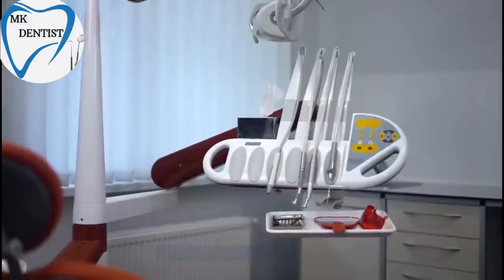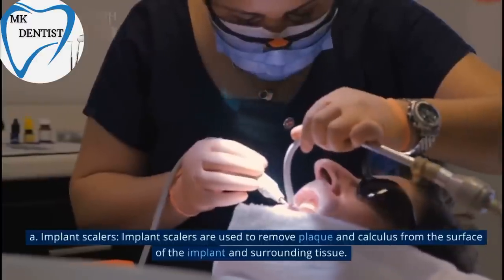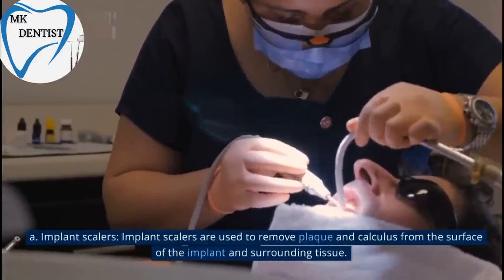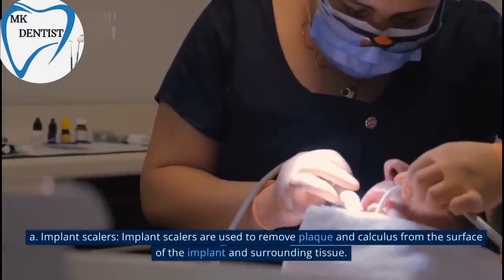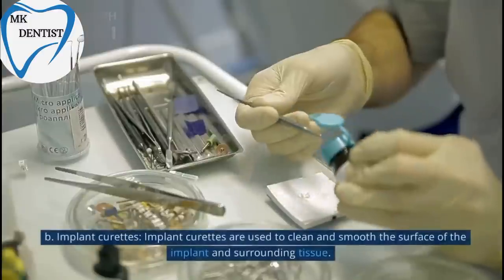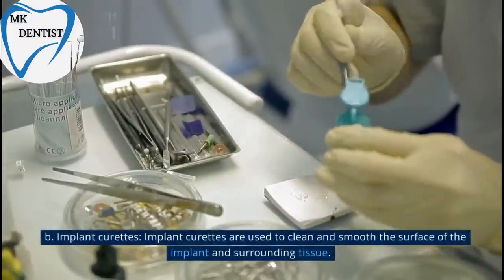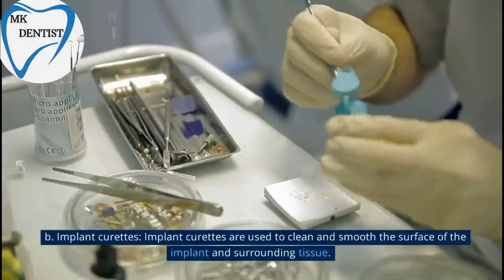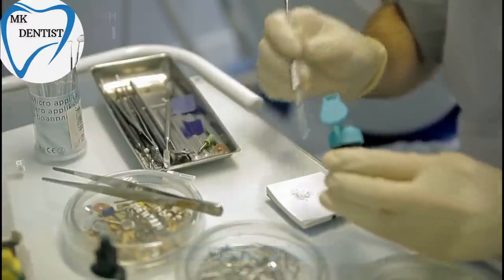Maintenance Instruments. A. Implant Scalers. Implant Scalers are used to remove plaque and calculus from the surface of the implant and surrounding tissue. B. Implant Curets. Implant Curets are used to clean and smooth the surface of the implant and surrounding tissue.